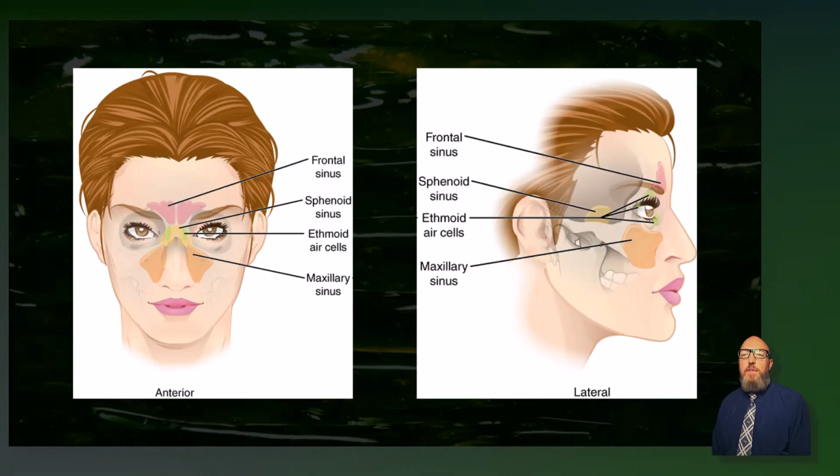This is just a brief foundation, so you're familiar with these paranasal sinuses and where they are. They are air-filled cavities in the face and skull. In health, they're lined by nothing more than a very thin layer of mucosa, so thin that you shouldn't be able to see it on a CBCT. They lighten the skull while preserving its strength. They humidify inspired air, and they're thought to contribute to our defense against infection. Because they're air-filled, they're radiolucent, and that dark background is what lets us appreciate the subtle opacities that we're going to talk about today.